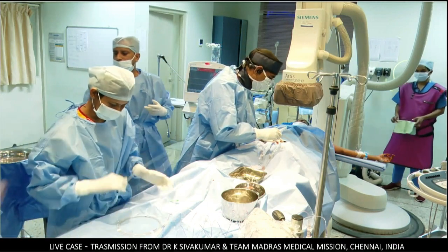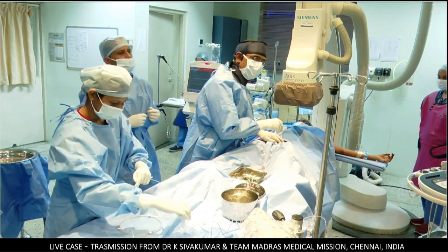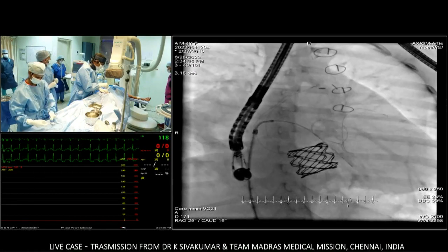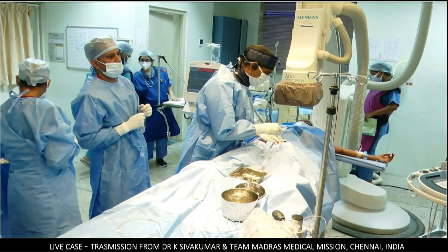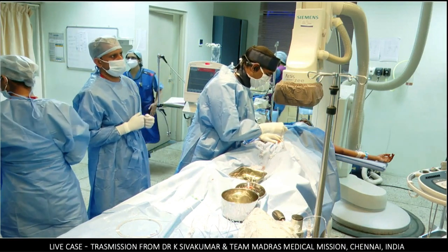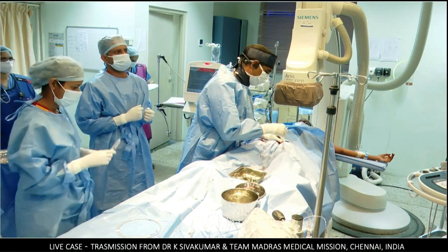Just do 100% oxygen testing? Not 100%. It is not 100. You do 100% oxygen without nitric? We don't check it nowadays at all. We always put nitric oxide. We don't check the pure oxygen testing that we used to do maybe a decade ago. We have stopped it. Now we are totally going only for the nitric oxide-oxygen combination.